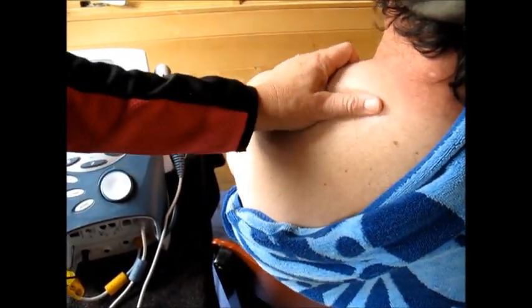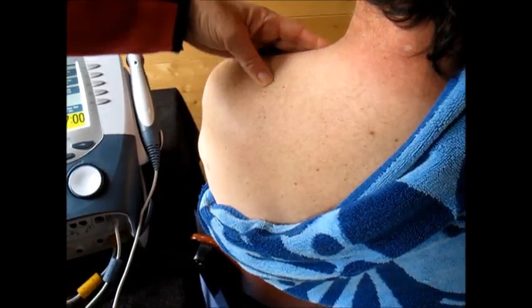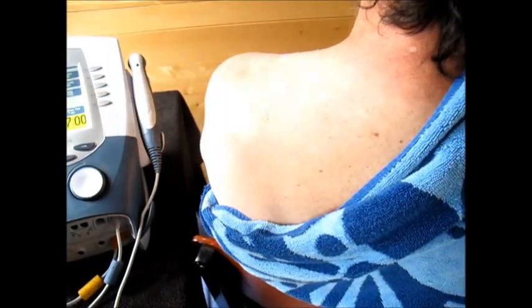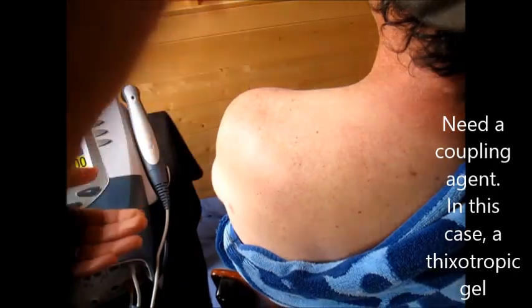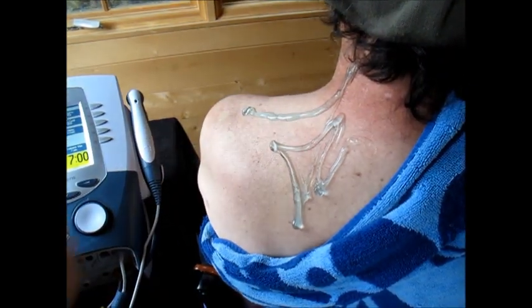It goes so deep — multiple centimeters into the skin — that it might actually get into some other muscles like the supraspinatus or the levator. I'm going to be using a coupling agent; this is the ultrasound gel we're using today, and it has to be a specific type of gel. If I were being nice, I would have warmed this up — you can warm your ultrasound gel just by running it under hot water.